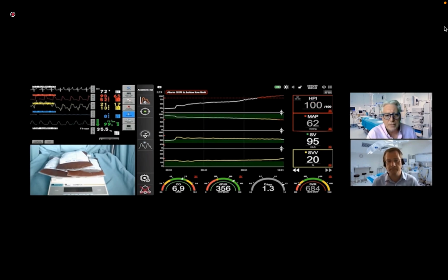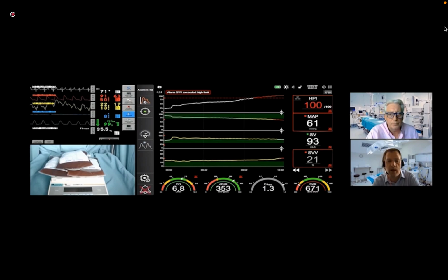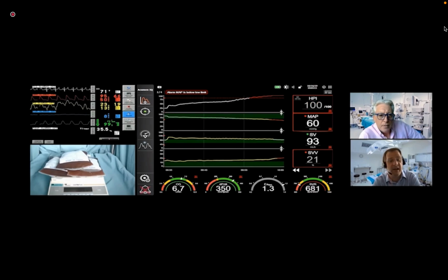So if you wait for this to act, and this is very representative, as I said, I have been involved in a number of human hemorrhage experiments and many animal experiments, if you wait till now, then you're way off the mark. Absolutely. If you're treating a CVP or a PA pressure or waiting for the pressure to drop, those are when you're becoming decompensated. So very, very late changes, and you've had significant physiological change up until that point.